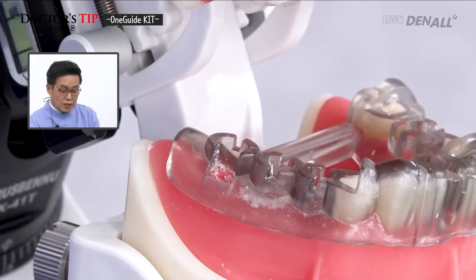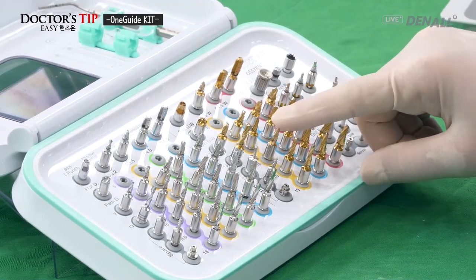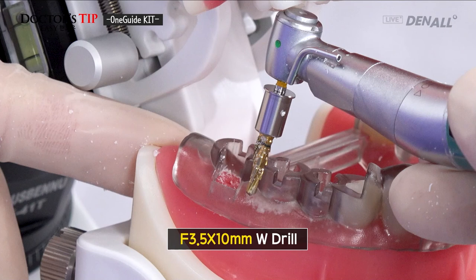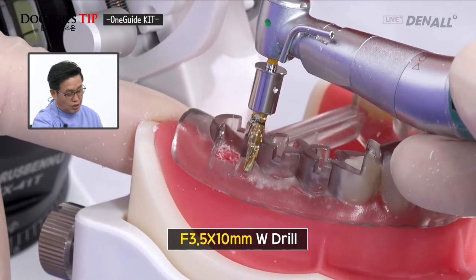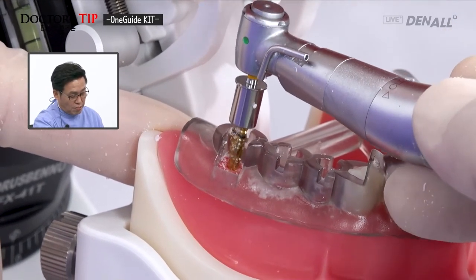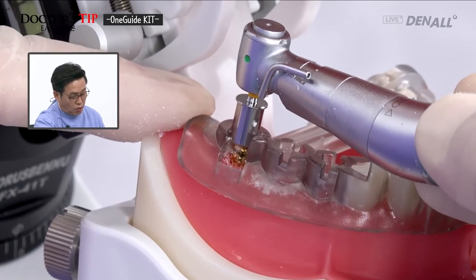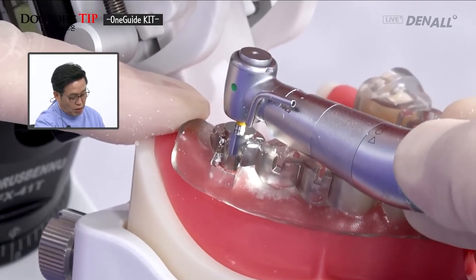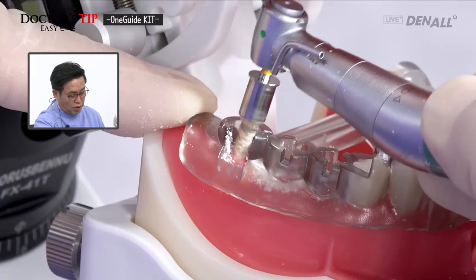Initial drilling is done. After that, I'm going to choose a 3.5 by 10 millimeter drill to do the next drilling. If the hole is closed type, it hits the opposing arch, but this is open type, so it is accessible. And I'm going to hold the template and accurately do the drilling. Up and down is going to be done. And for the final position, you're going to drill full length and check.